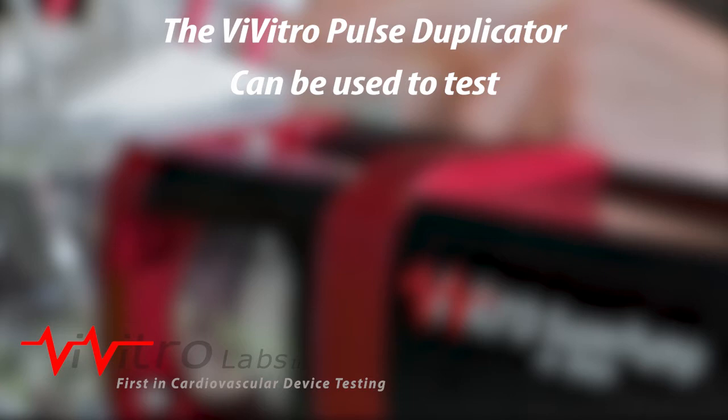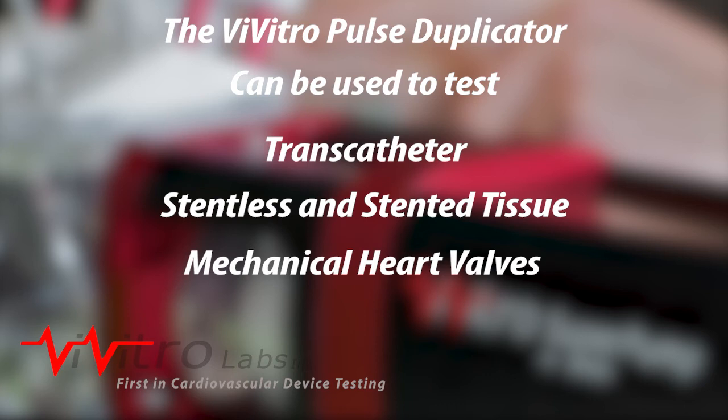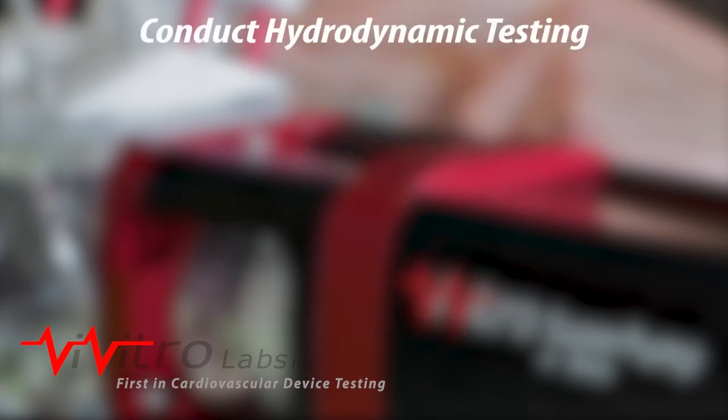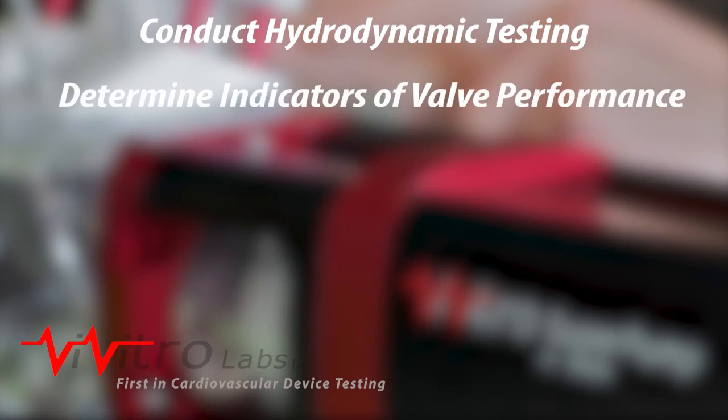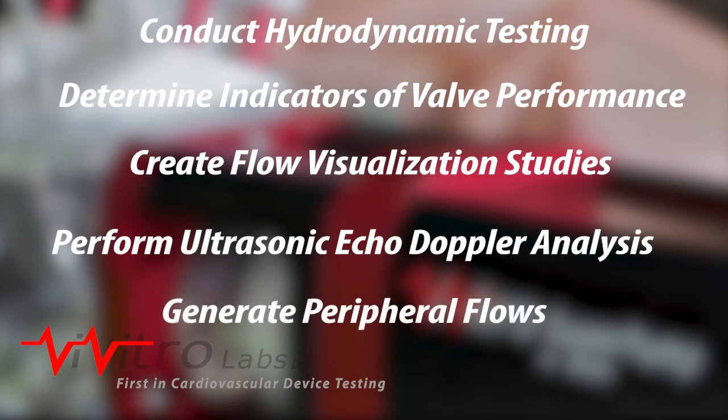The Vivitro pulse duplicator can be used to test transcatheter, stentless, and stented tissue and mechanical heart valves and other cardiovascular devices, conduct hydrodynamic testing, determine indicators of valve performance, create flow visualization studies, perform ultrasonic echo-doppler analysis, and generate peripheral flows.